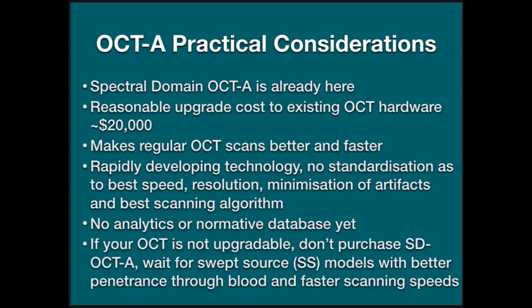So if your OCT at the moment is not upgradable, I'd say don't get rid of it and purchase a spectral domain OCTA. I would wait for the swept source models to come in. As I said, there's already the Topcon Triton, but we'll wait for some of the other manufacturers to come in to see if they're better and more powerful and if their software tools are better. And the advantage of swept source, it's a better OCT. It can penetrate through blood better.